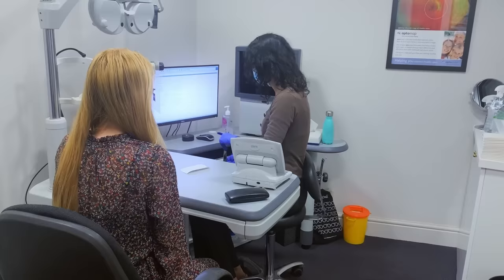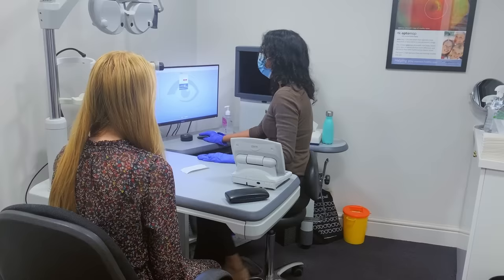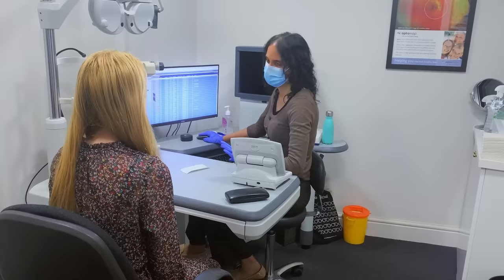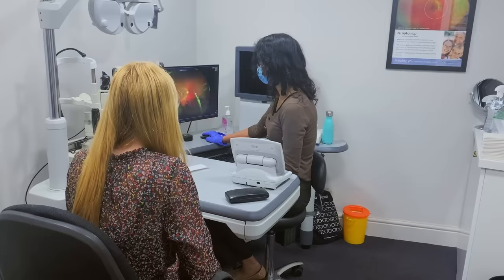Good. So now then I'll just show you what the photograph of your retina looks like. So this camera that we have is a very useful one because it looks much further out into the periphery of the retina. So we get a much wider and better view of the retina in general. Good. Wow. So this is your right eye, first of all, your right retina. Good, so your retina is looking great, perfectly flat and intact.